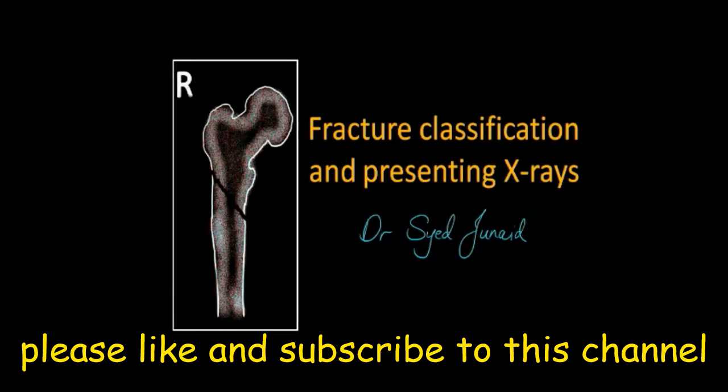In today's podcast, we'll be covering how to classify fractures that you see on X-rays. And quite often as a medical student, you are asked to present X-rays. It may be in an exam setting or in the clinic. So we'll be going through the vocabulary and the process of how to present an X-ray of a fracture. I also hope that you'll enjoy some of the artwork that I've created for this presentation.